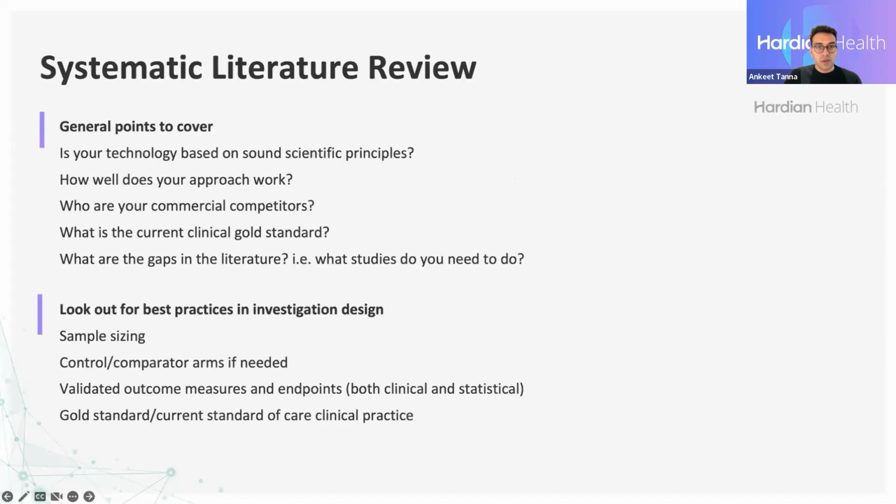Thanks, Hugh. So as Hugh said, for all software devices and all general devices as well, it's really important to conduct a thorough literature review done in a systematic way. And the scope of this review tends to be a little bit broader than the standard systematic reviews that are normally done in academia, and the aim of the literature review is slightly different.